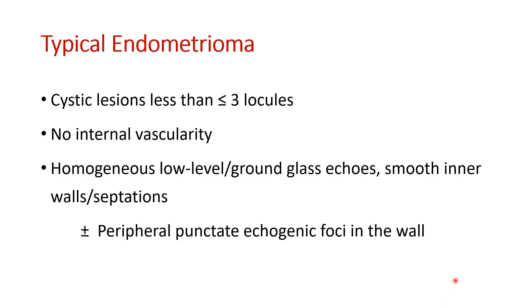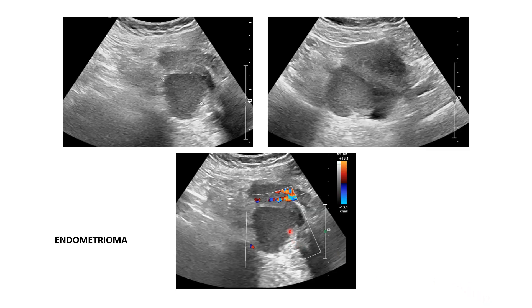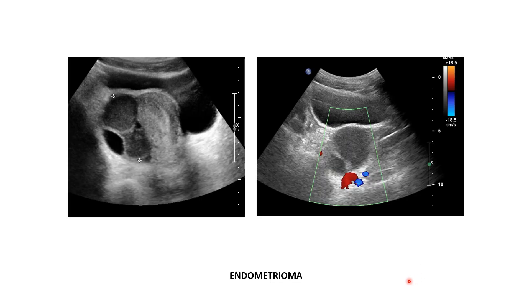A typical endometrioma has less than three loculations and no vascularity inside. The content displays homogeneous low-level echoes or ground-glass echogenicities, and the wall's septations are smooth. The wall may contain echogenic foci attributed to cholesterol deposits or fibrin particles. This is a typical endometrioma with homogeneous low-level echoes inside and no vascularity. Another example shows two components in ground-glass echogenicity — typical endometrioma components.